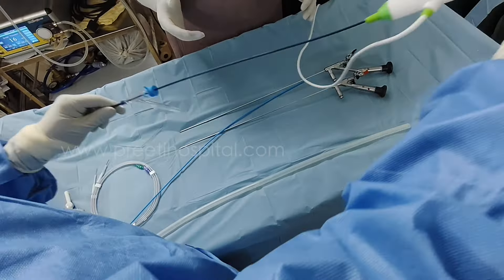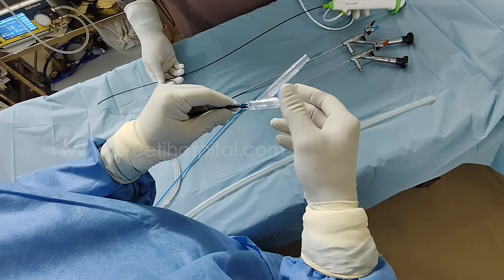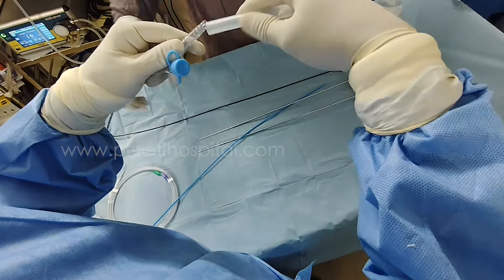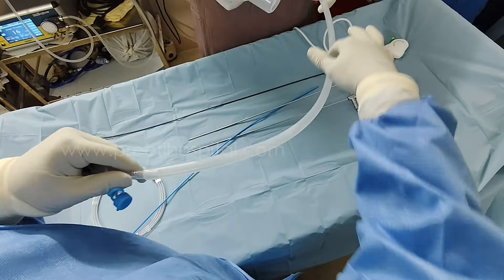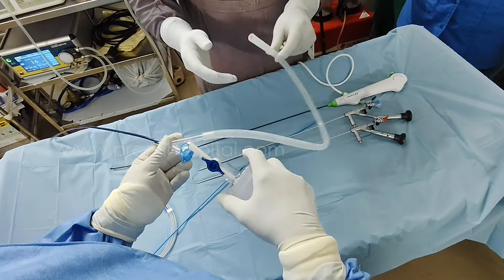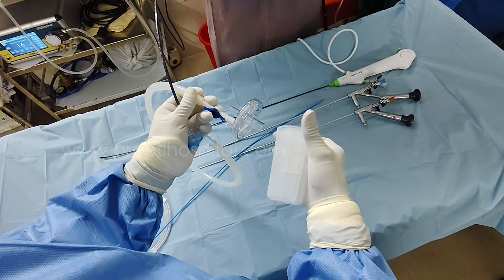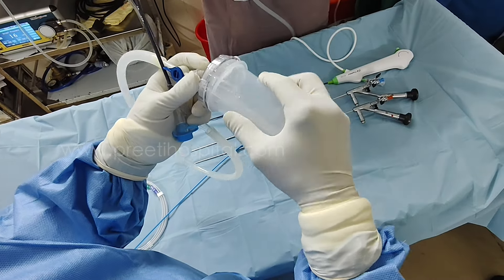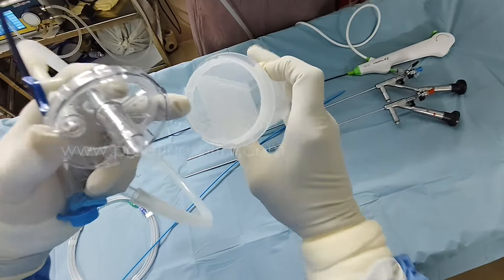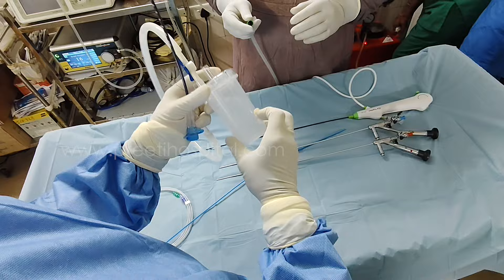As far as suction is concerned, the scope has nothing to do with suction because direct intra-scope suction is not possible. The basic mechanism is: you attach one pipe here — this length keeps it away from the penis and away from the patient. This is attached here to collect the stones. There is also one jali — can you see the jali here? In this, powder and pieces can be collected separately.